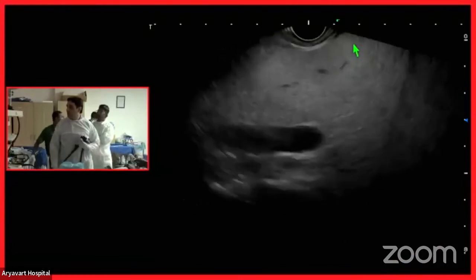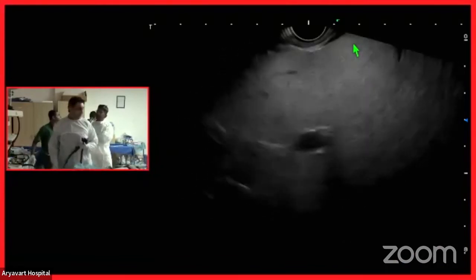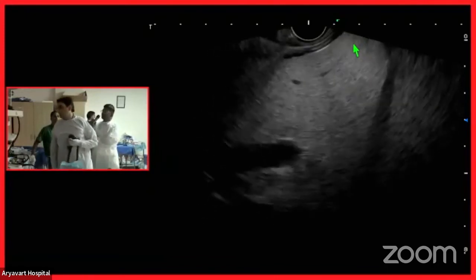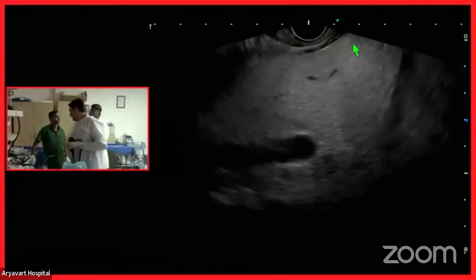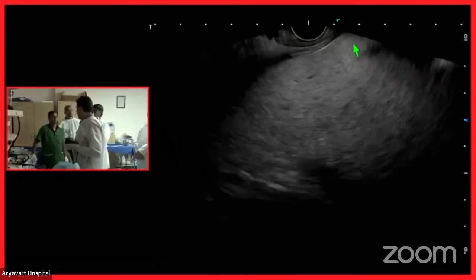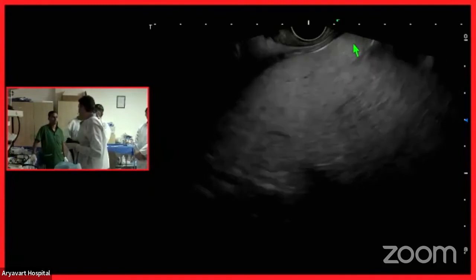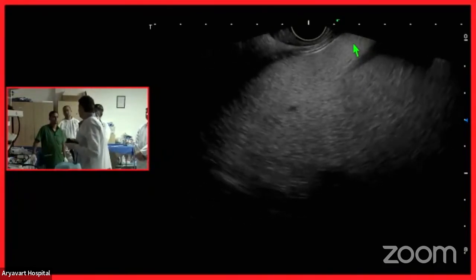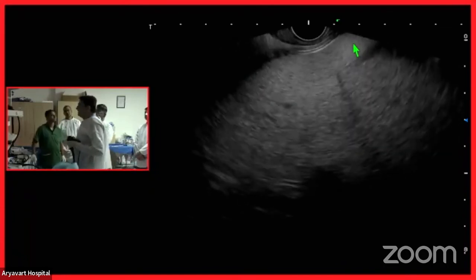At present, there are no signs of bleeding. It is the same as what we saw prior to the procedure. So definitely post biopsy, you should apply Doppler. We should remember to keep the same field in view so that you can compare before and after. After 5 minutes, if you see it's okay, you don't require special precautions like turning on any side. The patient is just like a normal FNA and can go home within 2-3 hours.